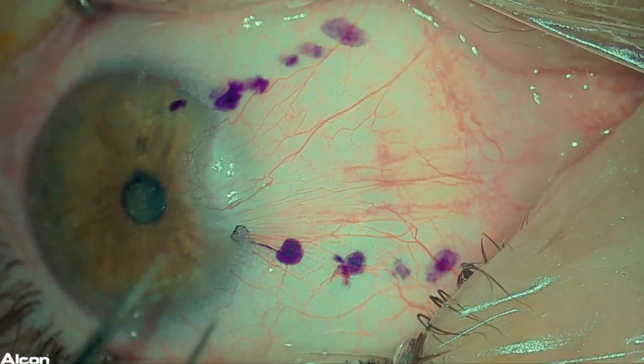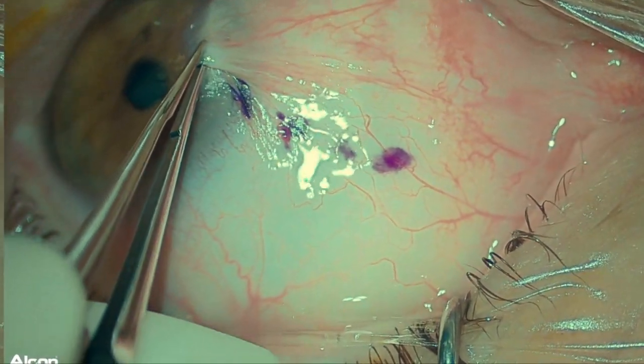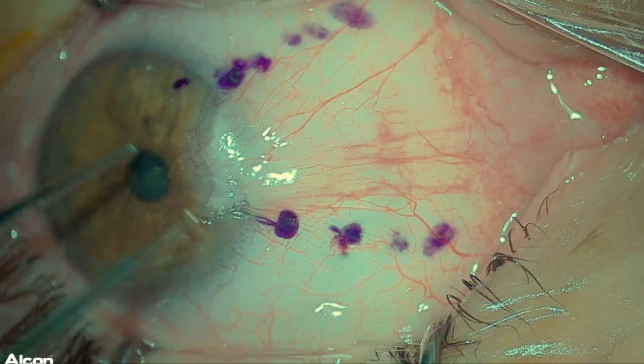I then like to avulse the head of the pterygium using a 0.12 forceps. Once you find an appropriate plane, the tissue dissects quite easily.